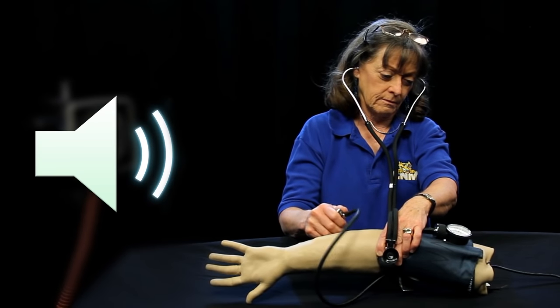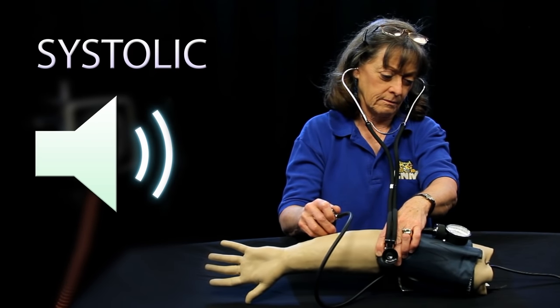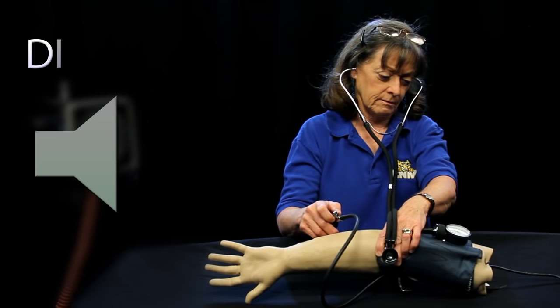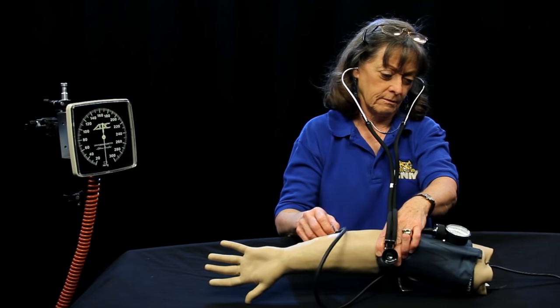The skill we are practicing is to coordinate what you hear with what you see on the gauge. You will listen for the first sound, which is the systolic blood pressure. Next, listen for when the sound stops. This is the diastolic blood pressure. Then write down your measurement.